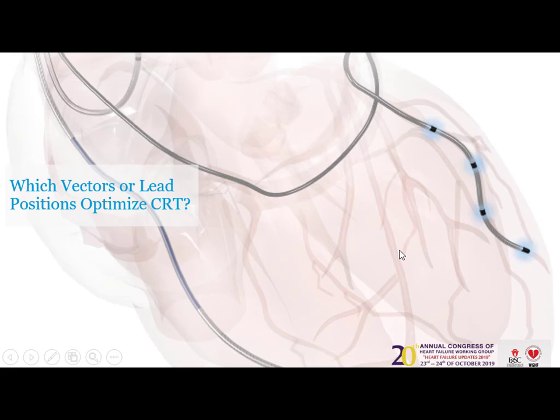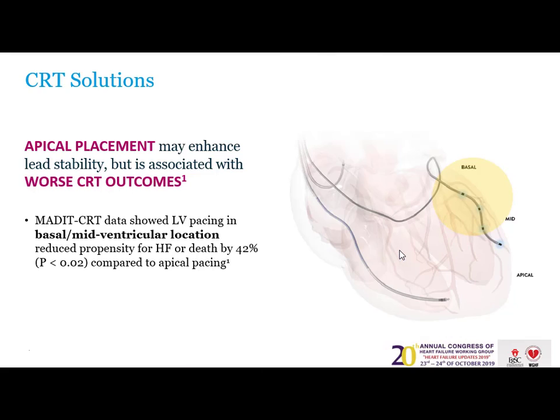We used to do this by echocardiography in the echo lab with our echo team. They were very patient with us. We changed the configuration, VV interval, AV interval, the sense and the pace. It took us a long time to do this, until they invented the better solution I will show you.